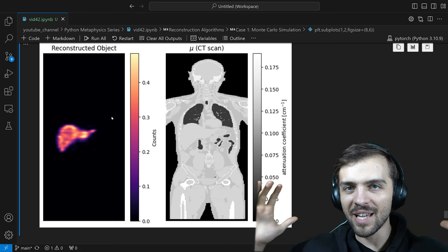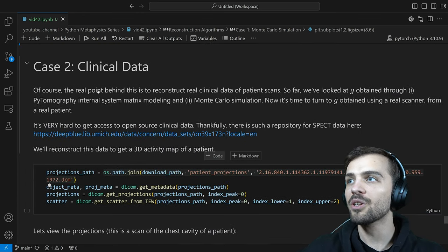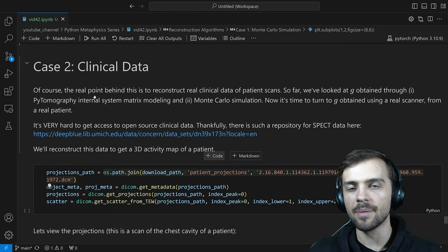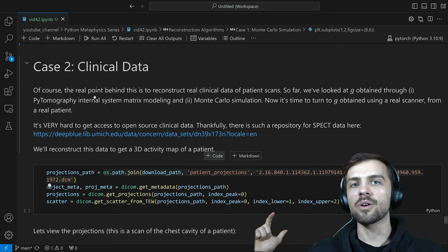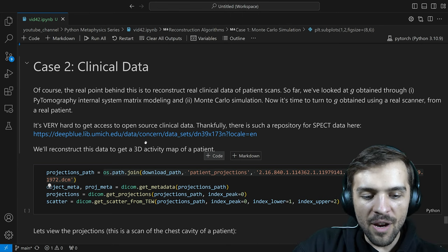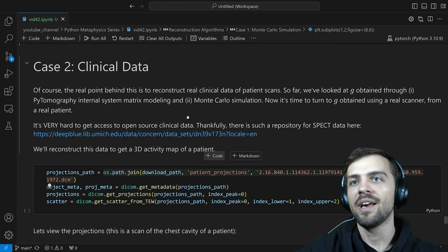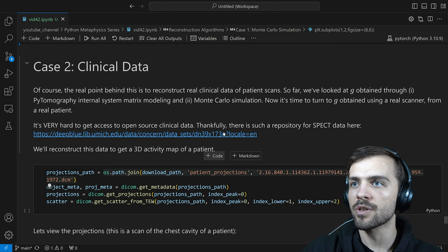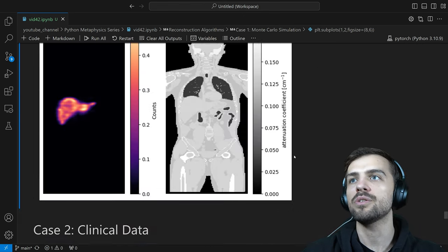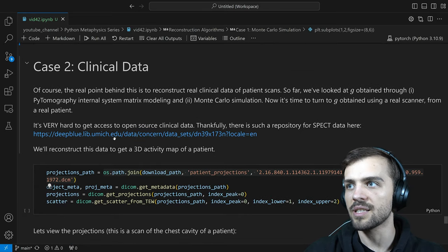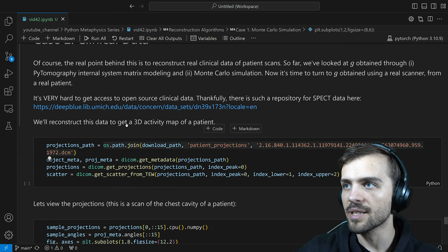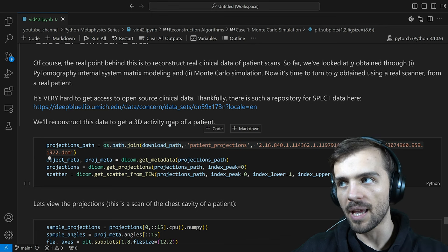We've reconstructed data from a Monte Carlo simulation. Now we get to the real deal — data collected from real life. We'll look at clinical data. You have a patient with radioactivity in them, you take a picture G of that patient, and you want to use a reconstruction algorithm to get an estimate of what the original distribution looked like. It's very hard to get access to open clinical data, but thankfully the Deep Blue repository provides real SPECT data of a patient as open source.